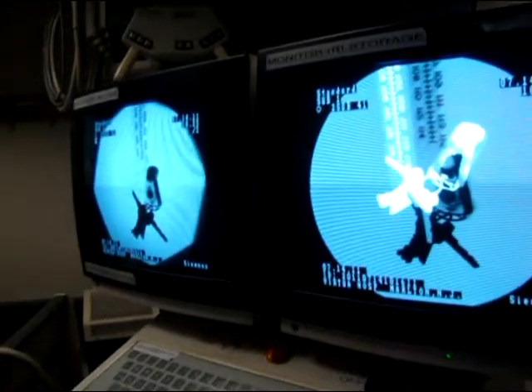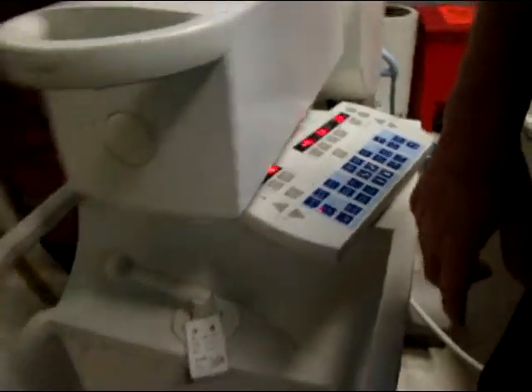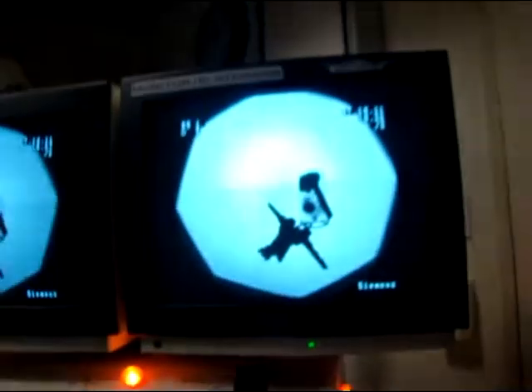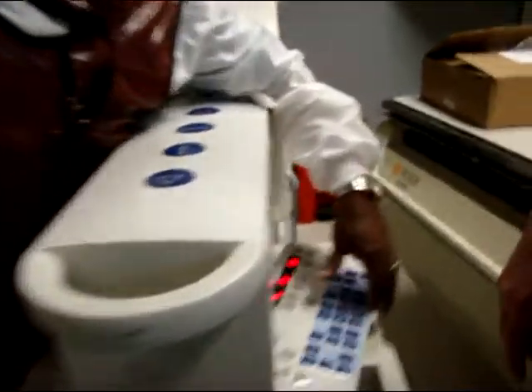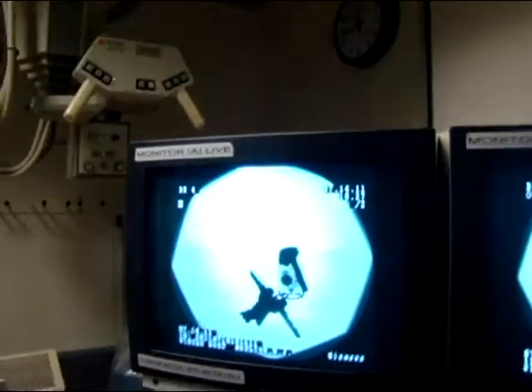You've got a couple of boosts on this. You have the DR — your digital — which gives you one quick off and on, like one shot they call that. Even if you hold the button down, it only gets you one. But if you have a big heavy patient, you go to five — see DR all the way up to number five. That's your strongest.